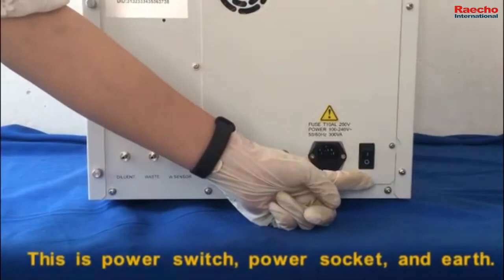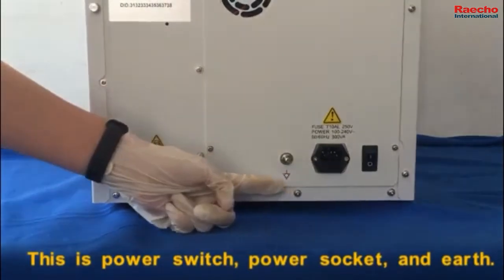This is the power switch, power circuit, and earth connection.